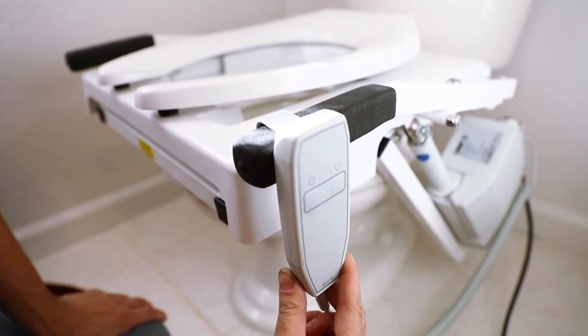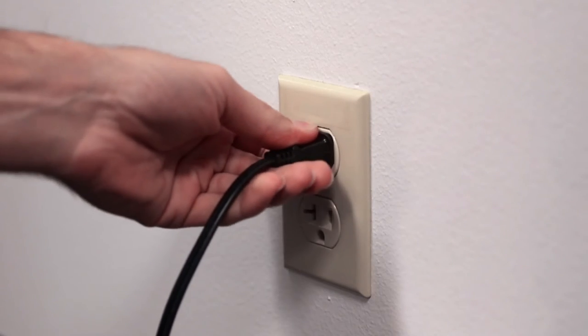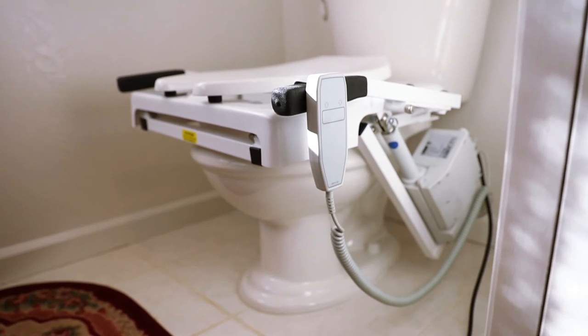Simply hook the push button control on the arm and plug the unit into a standard wall outlet nearby. Congratulations, you have successfully completed your tilt toilet incline lift installation.